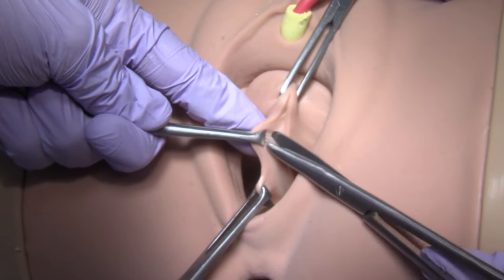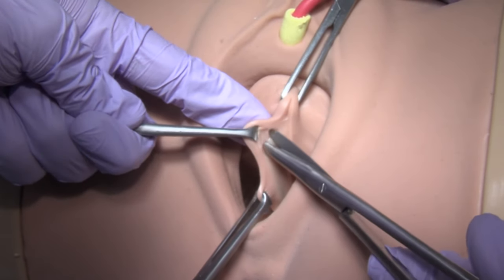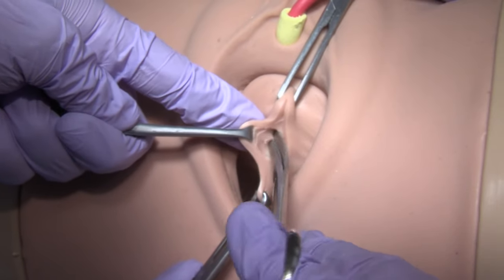Dissect the underlying vaginal muscularis from the epithelium to the margins of the dissection bilaterally.